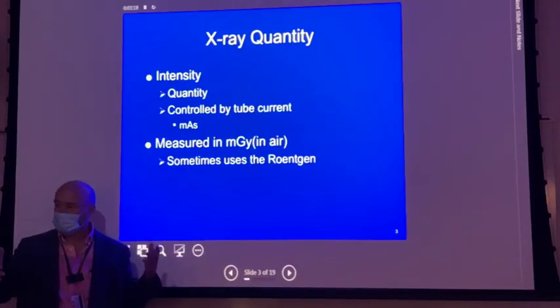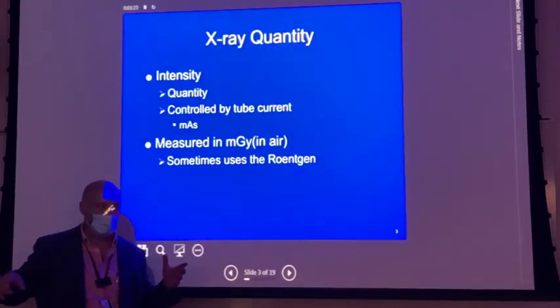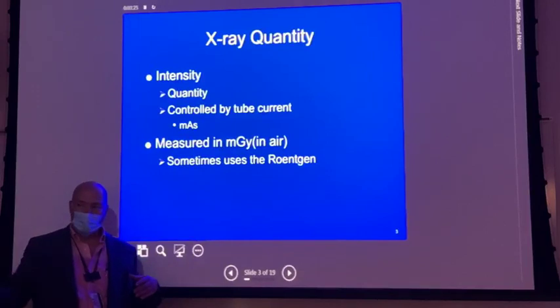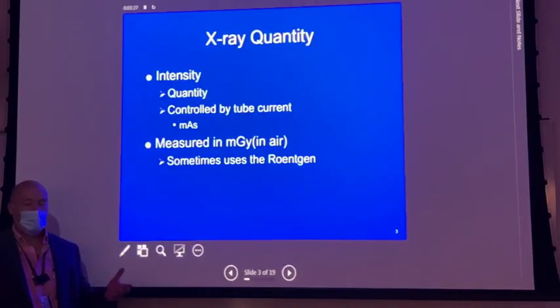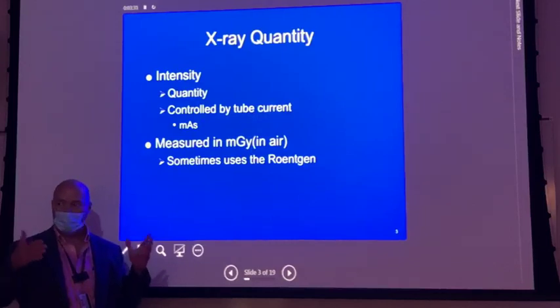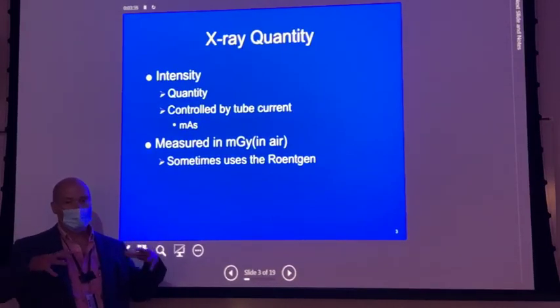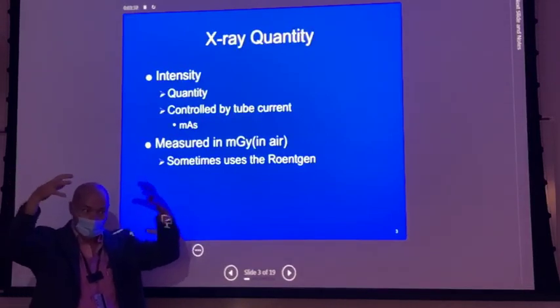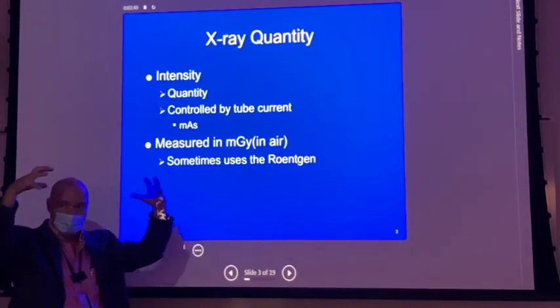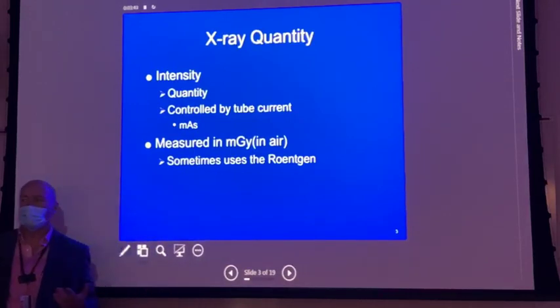The brem spectrum was that thing that's like an elongated bell curve. And when you increase your KVP, think about everything that happens with that brem spectrum. The end that goes towards the high energy side extends out further, so you get a lot of increased number of X-rays, not just directly above, but also on that high energy end. So you don't really know what's going on with it, right?